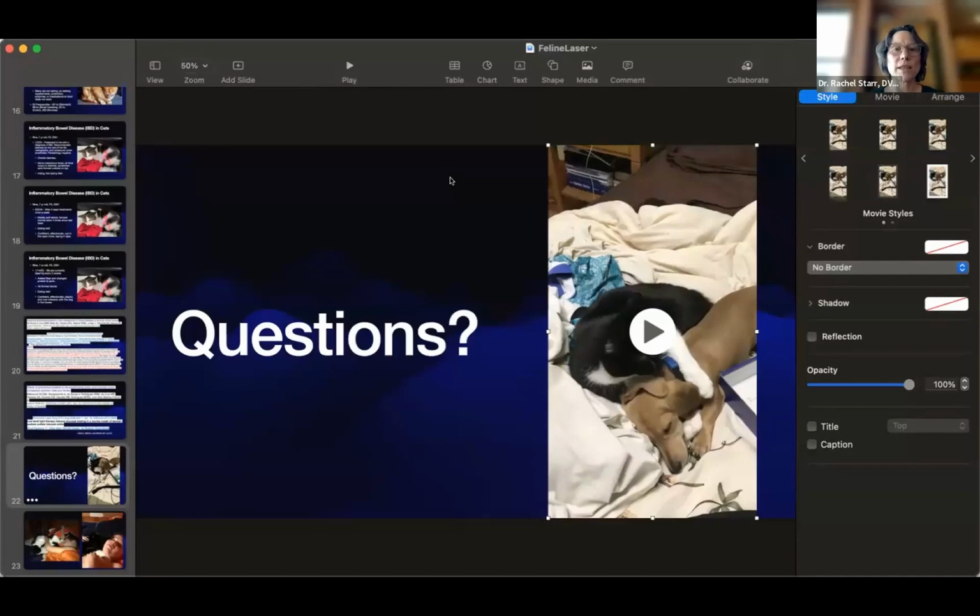The question is, have you used photobiomodulation in dilated cardiomyopathy or AFib cases, cat or dog? Also, have you used it on spleen immunological response? Yes, I've used the lasers in dilated cardiomyopathy. I have not for AFib, but I definitely see dogs with dilated cardiomyopathy improve symptomatically, like coughing goes down. They tend to have more energy and are able to perform better. So I have definitely lasered hearts. I don't know that it reverses dilated cardiomyopathy, but again, with more ATP output, you're going to have better response, better energy.